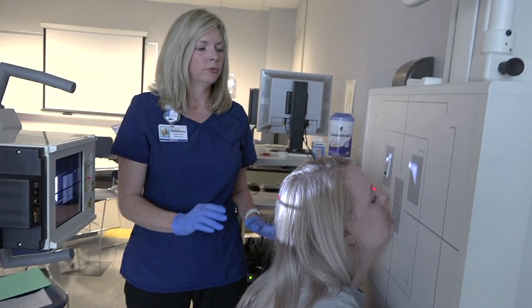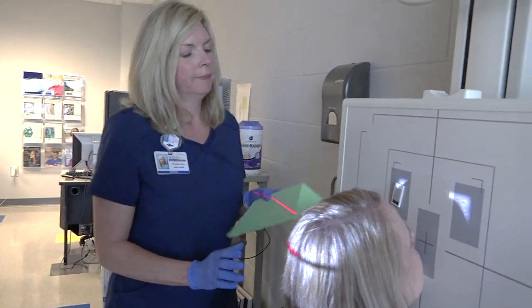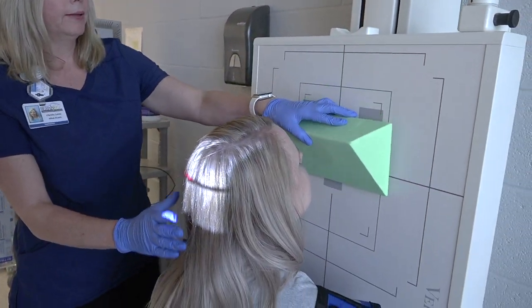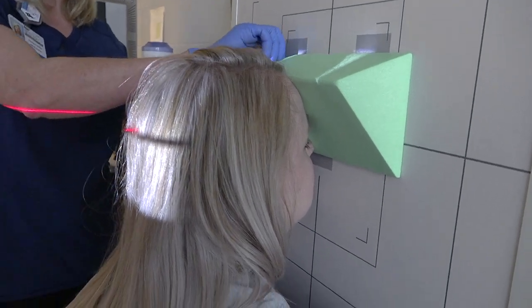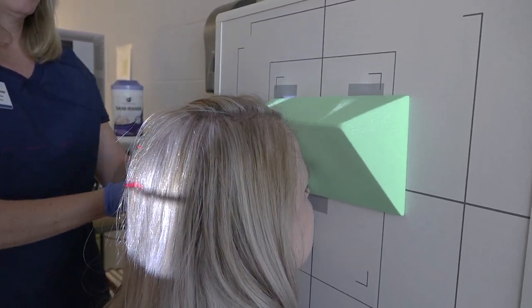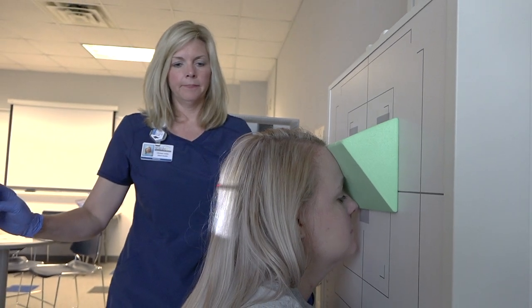Now we'll go to the PA. So we don't use angles with the sinuses, but we will use this sponge. If you'll move your head back, and then we're going to still kind of tilt your head down. There we go. If we use the sponge, it kind of simulates the 15-degree angle for the PA.